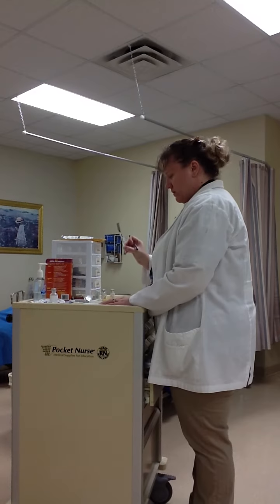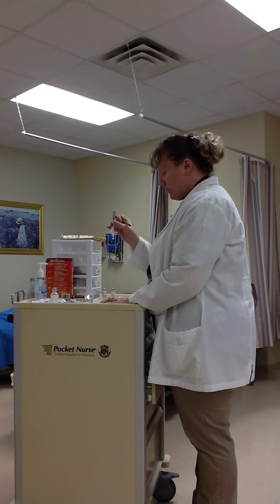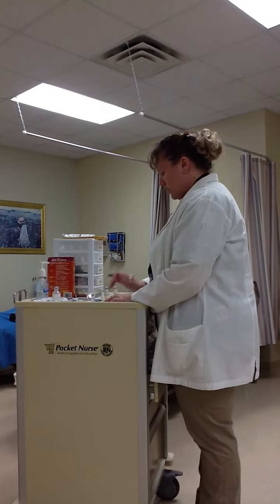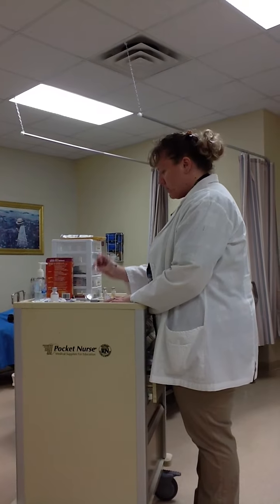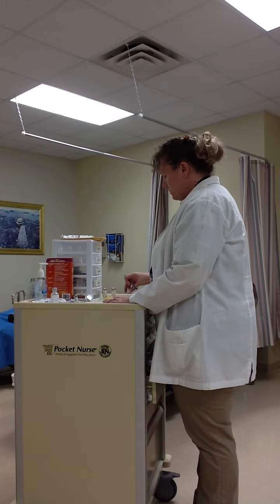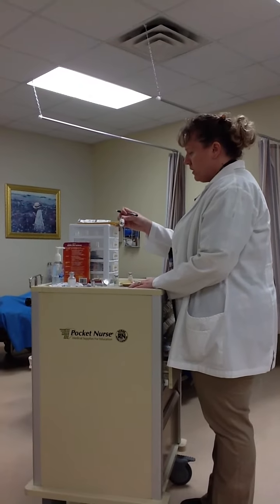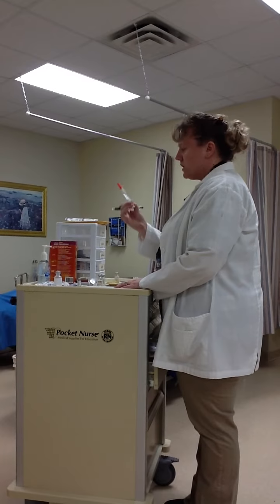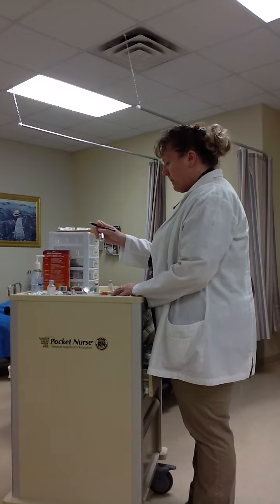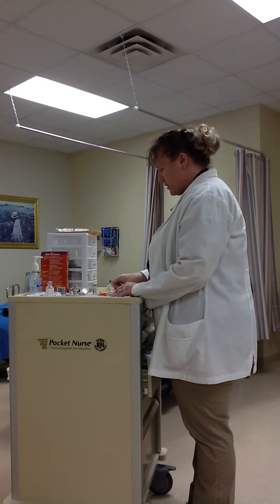I now have my PPD. I'm going to bring that vial back over just for this one last check. I have PPD because I know I labeled it at 0.1. It's still at 0.1. It is intradermal. It is due today. And it expires on 20 of 20. That tells me that's my second check. I'm going to look at my insulin again. I have regular insulin because I labeled it with 4 units, regular insulin at 4 units due to a 225 blood sugar. It expires December of 2012. That is my second check.